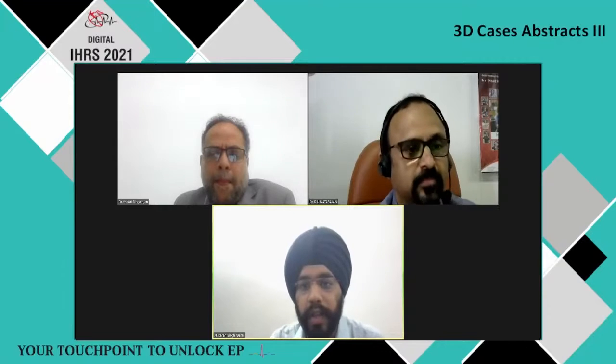In one sentence, what was done differently in this case compared to the usual post-MI scar VT? Just one sentence, to summarize, because I joined a little later. What is unique about the case that you did? Sir, use of isochronal mapping. We first highlighted the isochronal crowding areas, and then later on we confirmed that the VT isthmus was adjacent to the areas of isochronal crowding. Okay. Thank you, sir.